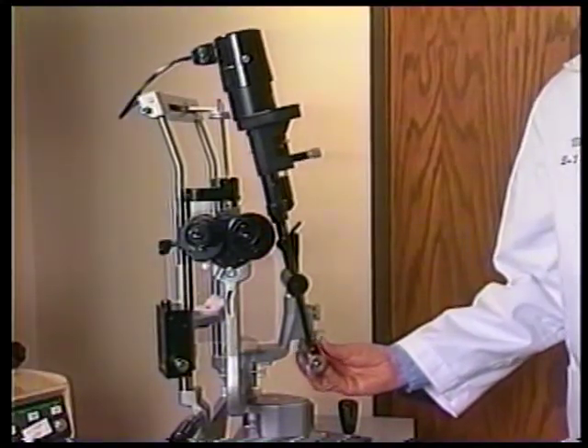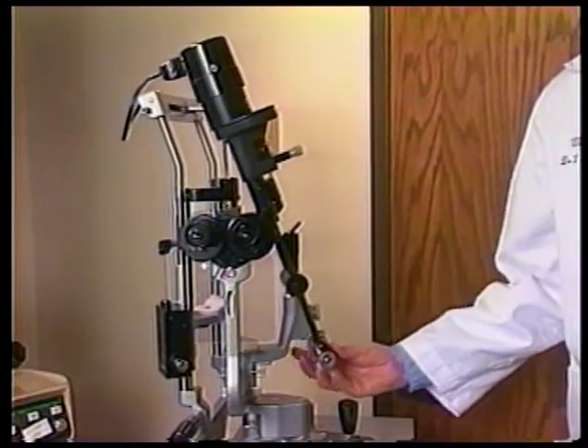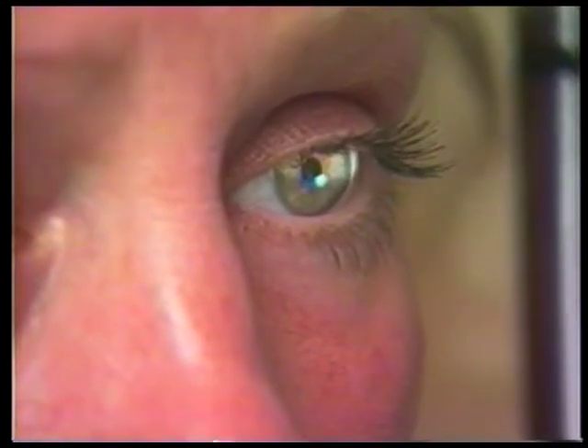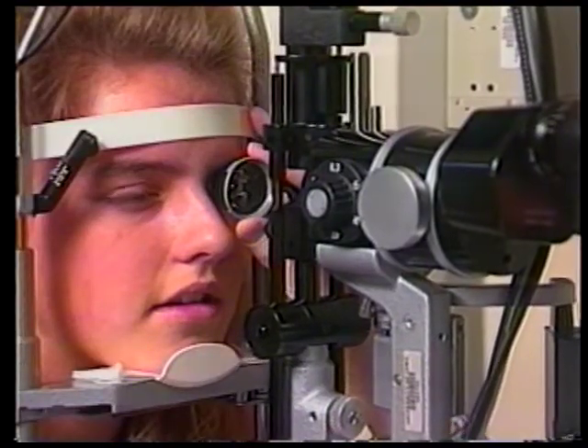The Haag-Streit slit beam can be inclined or tilted by depressing the latch at the base of the lamp bar. By tilting, rotating, and coaxially setting the slit beam to horizontal, and using the Goldman three-mirror fundus lens, the peripheral vitreous and retina exam can be optimized. Utilizing the tilt feature with a horizontal slit beam can eliminate unwanted and interfering light reflections in all methods of fundus biomicroscopy.